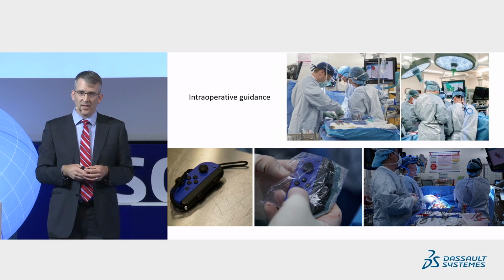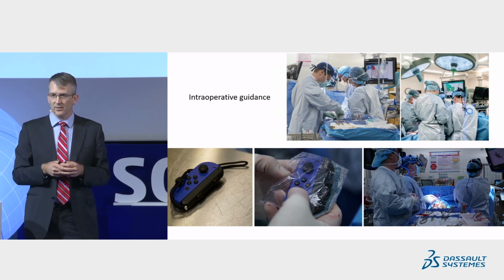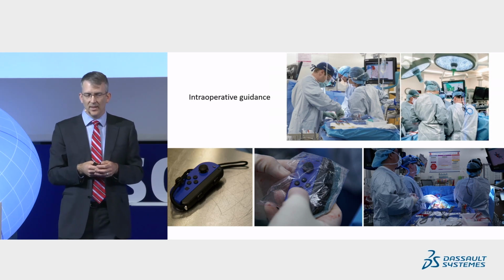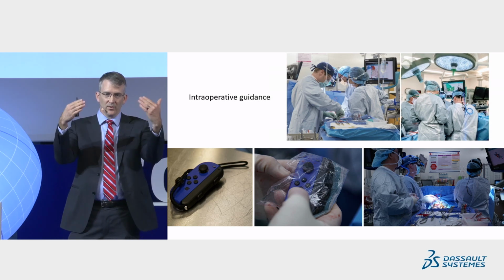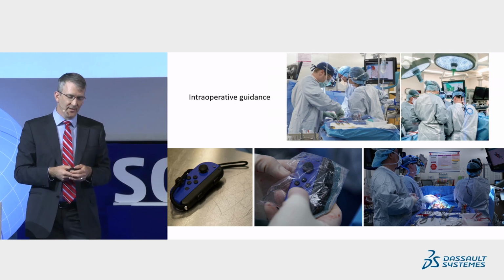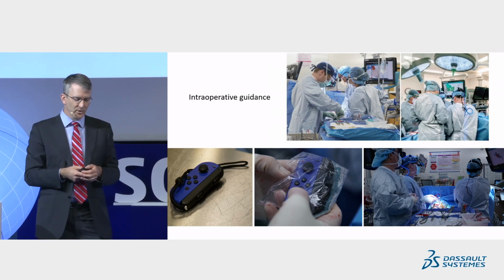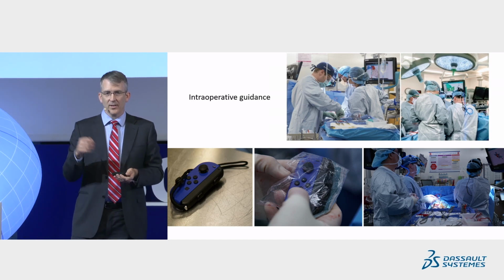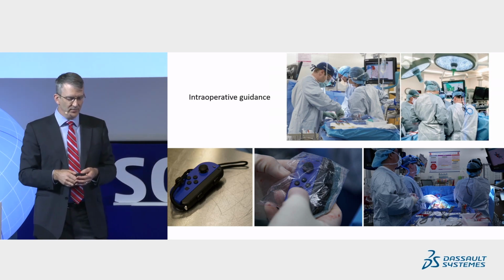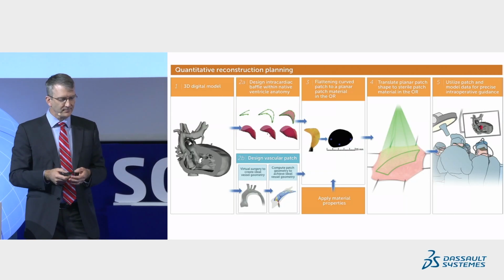We use these models in the operating room at Boston Children's almost every single day. We have access to the model through a web-based viewer from Materialise called the Mimics Viewer. We can pull it up on a screen in the OR. We have clever engineers who have reprogrammed the Nintendo Switch controller. For those of you with children, you'll recognize this. We actually have that in a sterile bag on the field. We can manipulate the model and use it for intraoperative guidance.